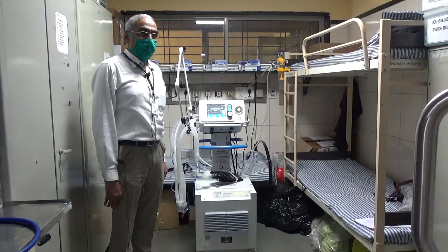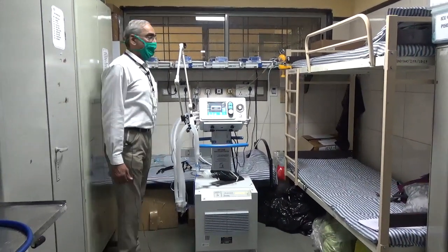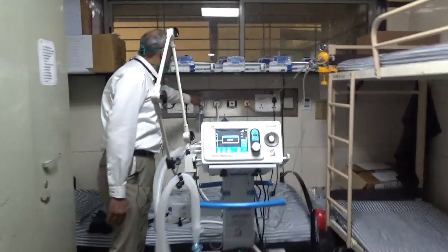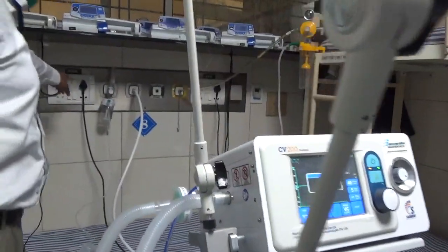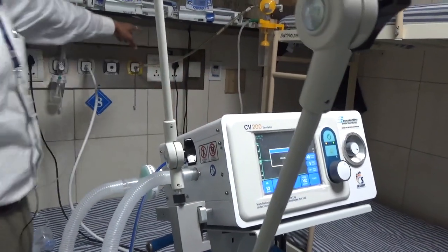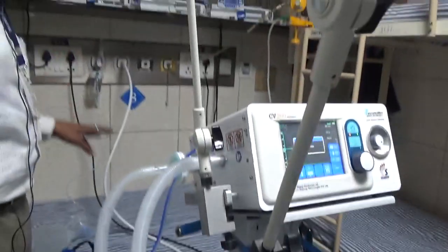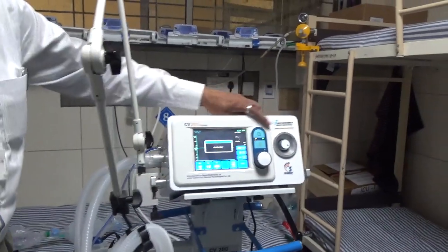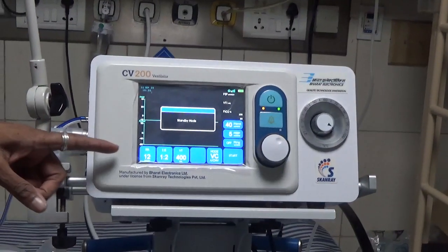So before I tell you about non-invasive ventilation, let me tell you how to set up the ventilator. You can see that there is an oxygen supply coming to the ventilator. There is the electrical supply of the control box or the main ventilator, and there is electrical supply of the compressor. You have to connect all these things and switch them on. Once you have switched them on, then you switch on the control box with this button here. The moment you switch it on, you will see these default settings.